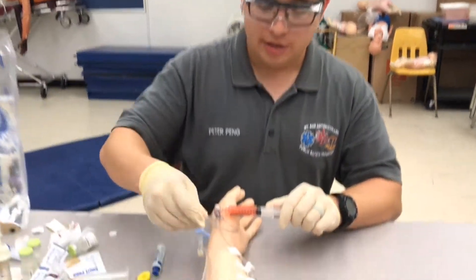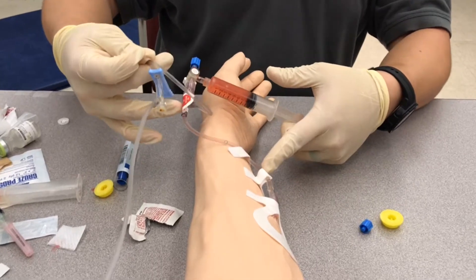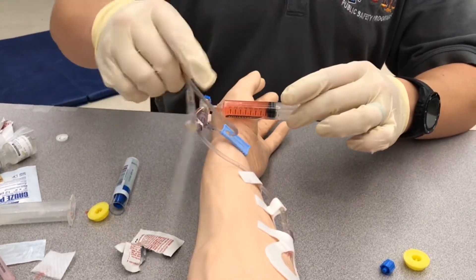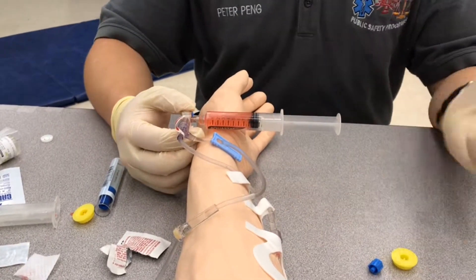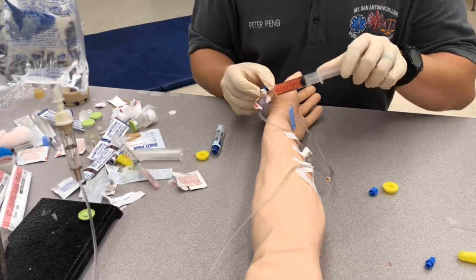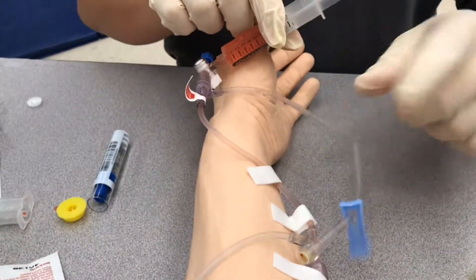If you didn't do the pinch and release, you'd basically have that whole mL of epi sitting right there, and as soon as you release, you have the entire mL infusing all at once — so it's no longer a slow push. Make sure you do your pinch and release so it's a slow IV push, and make sure you reassess your patient for desired effects and adverse effects. Just to demonstrate what happens if you don't pinch the line above: if you push it, the medication goes both directions. So make sure you pinch above and do your pinch and release.